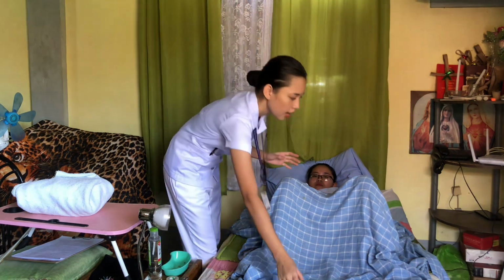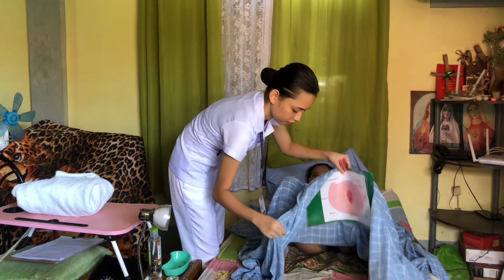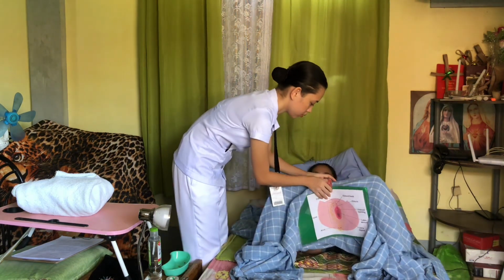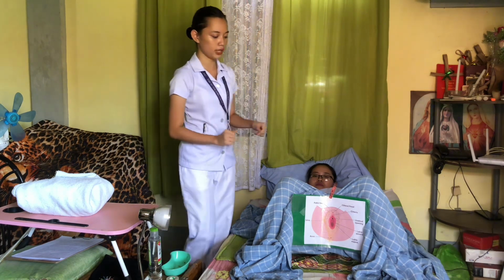So the next thing that I'm going to do is to drape the patient, exposing only the area that will be used. So ma'am, I'm going to expose your private area. This is done to avoid the patient from getting embarrassed and having chills, which causes tension and which may interfere with the easy insertion of the catheter later on.